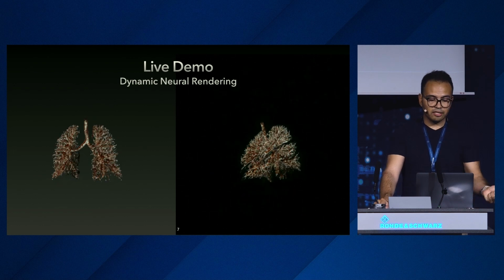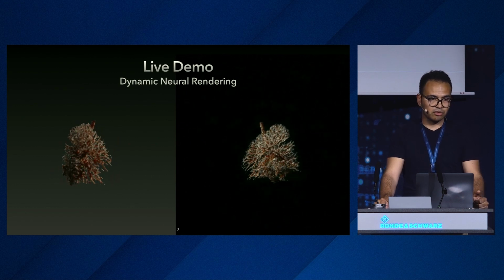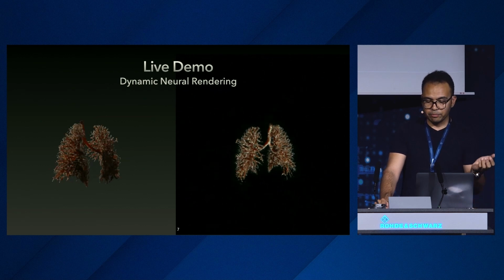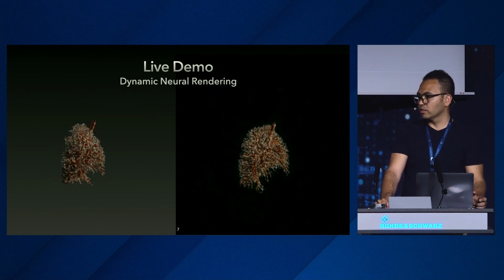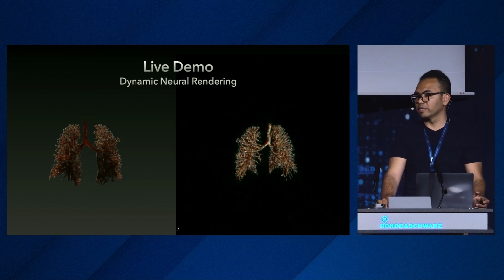We want fidelity of reconstruction of important landmarks. Sometimes this is the thing that we mostly care about. And movement encoding following the breathing pattern as observed in the patient. So tracking, for example, how the lungs are evolving in time, not only with CT scans pre-op, but also with modalities that are arriving in real time.